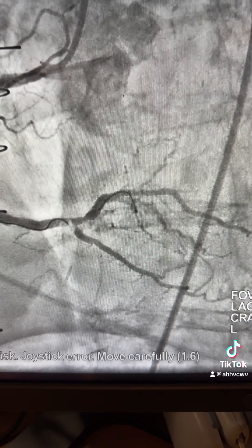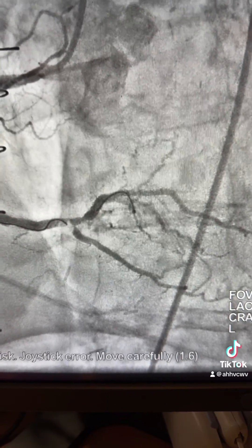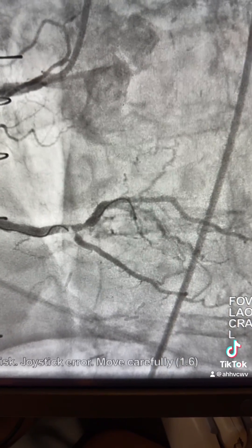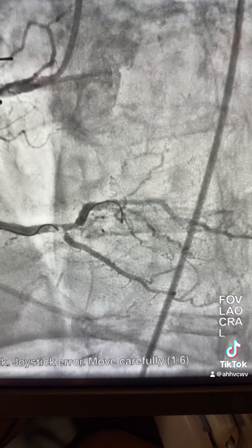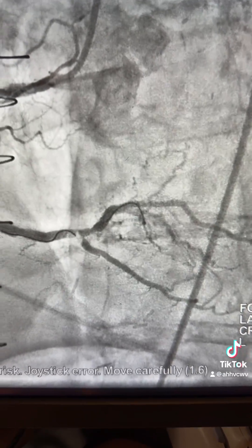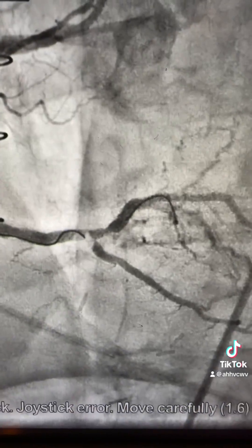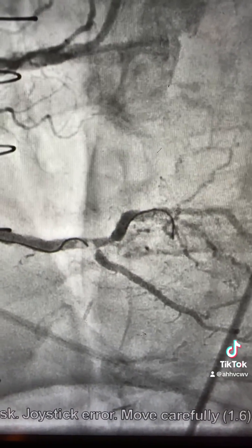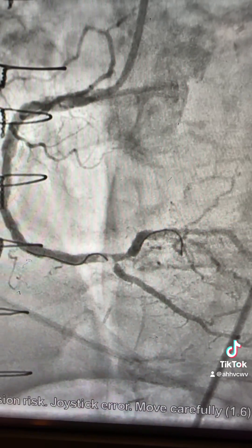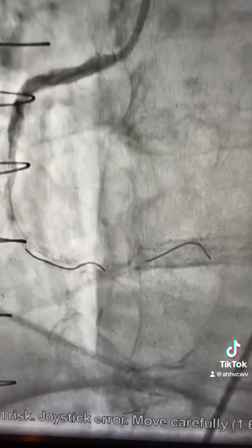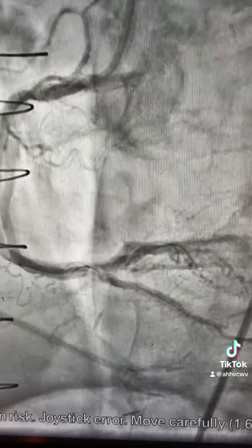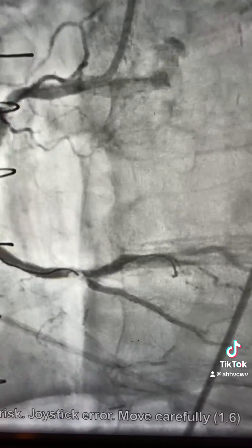Hello, presenting today a complex bifurcation lesion — tips and tricks on how to wire the side branch when you have a heavily calcified ostial branch lesion that is difficult to wire. This lesion is in the distal RCA, directly after a stent, and is heavily calcified, involving the ostium of the PDA.